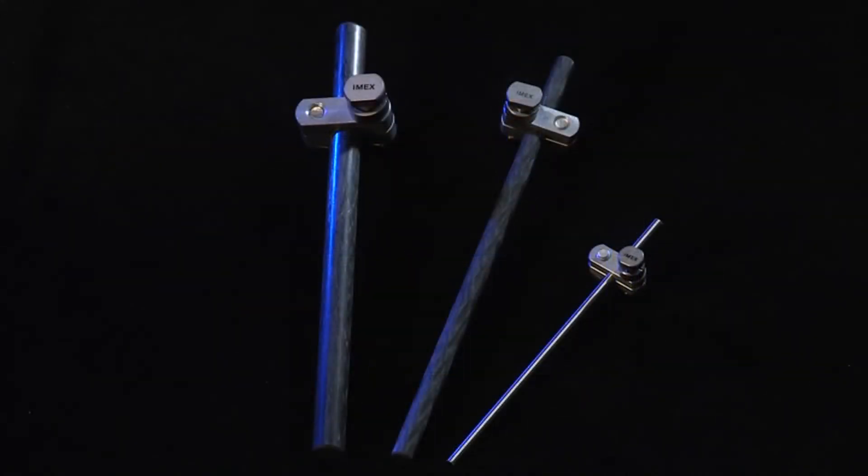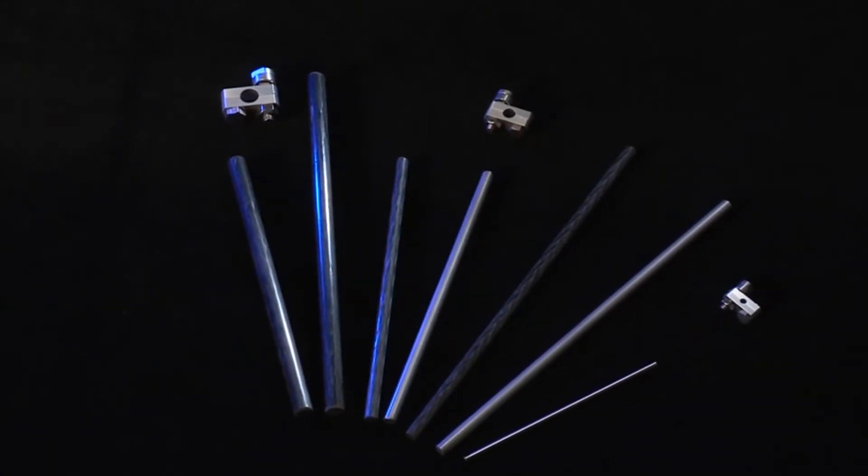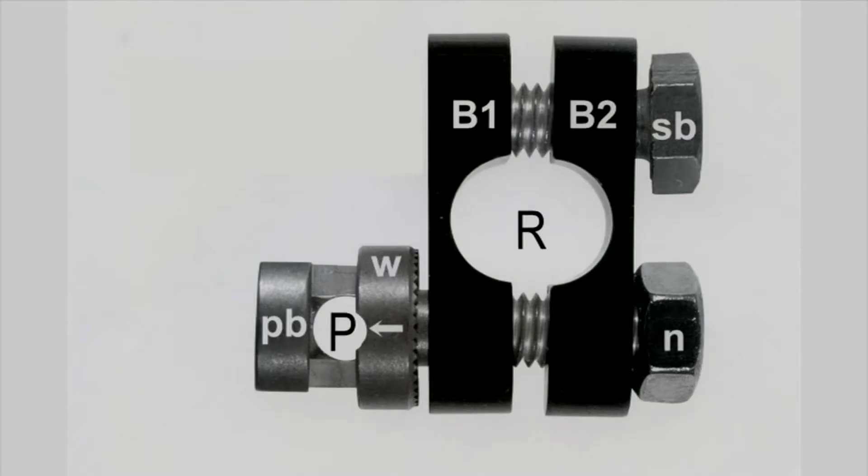Currently, the SK ESF system is available in three sizes: mini, small, and large. Each size represents a scaled up or scaled down version of the basic SK fixation clamp and rod. Let us review the anatomy of the SK single clamp.